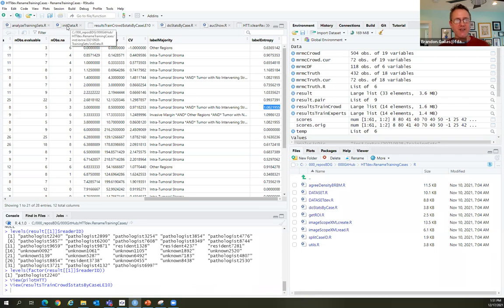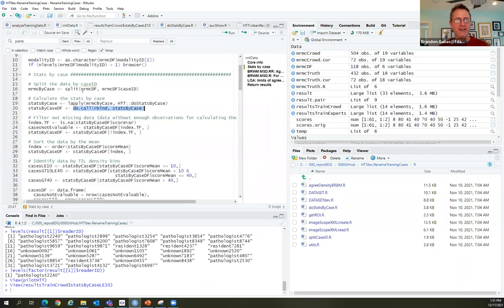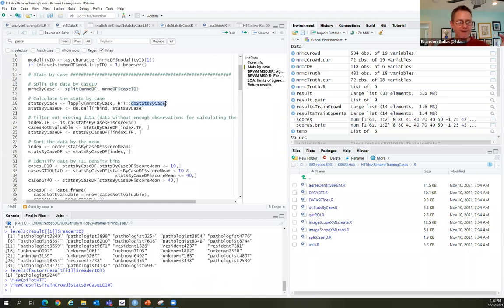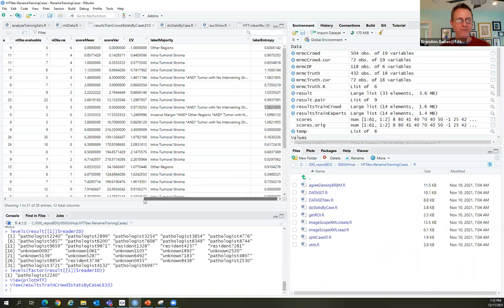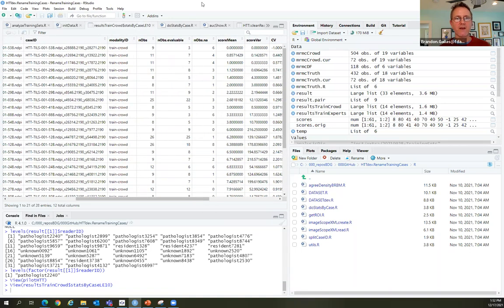The data frame has batch, WSI, case ID, modality ID, count of observations, how many were valuable and how many were not, the mean score, score variance, label majority, and label entropy. When there's an even split, label majority indicates that. You can see that when they have more labels, we get a higher label entropy.